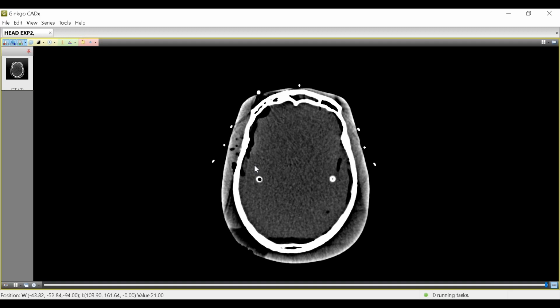Essentially, we created our network. We've passed an image. We're looking at it on a workstation. The only thing that's stopping me from having two machines is the fact that I did it on one machine with the same bits of software running on this machine under the same login. You could go at home and do this.